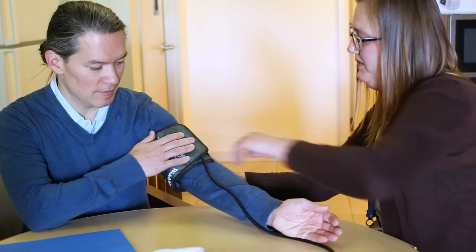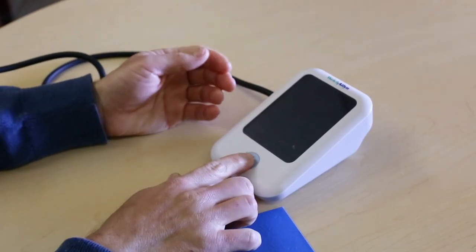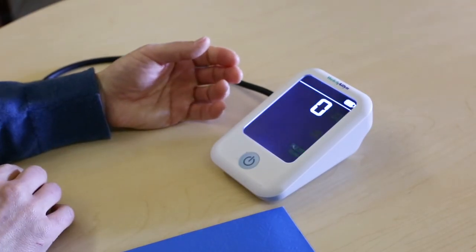Also note the blood pressure cuff is printed upside down so that it can be read while on your arm. Make sure the blood pressure cuff tubing is plugged into the side of the machine.